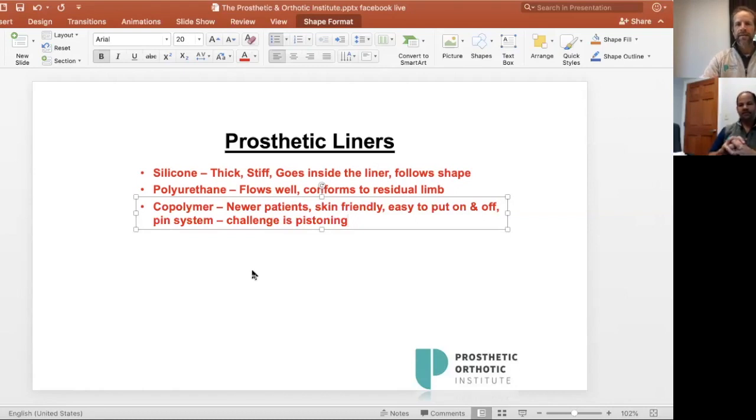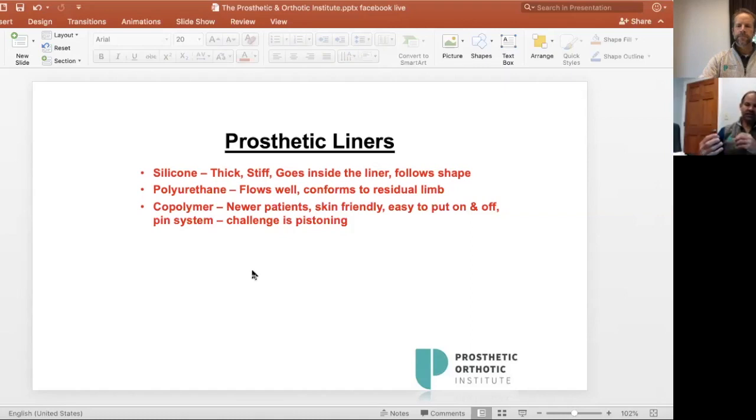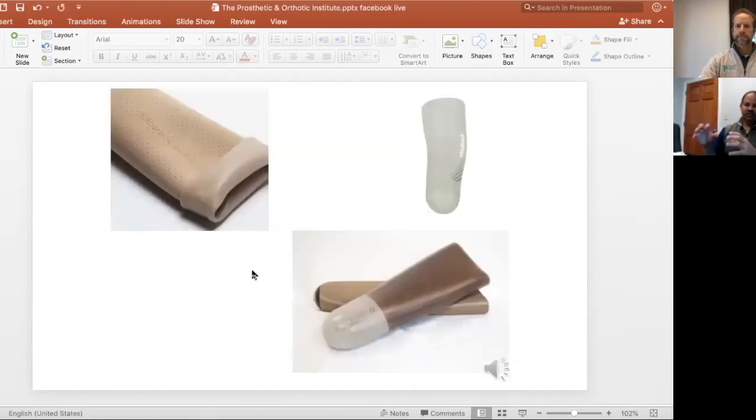So that makes it easier for the patient because it feels like it's more a part of their body. Is that correct? Sometimes I'll have a conversation with our patients, for example, about animals. Cats' whiskers are their proprioceptors, telling them where they are in space. And we as humans take consistent steps throughout the day, right? We know where our feet are going to land. That provides proprioceptive feedback for where we are in space and our environment. The same thing happens with your prosthesis. The more we're able to contact that residual limb and actually attach to that residual limb, the better proprioceptive feedback our patients are going to have with the use of their prosthesis, which means they're more confident during walking and activities outside of the office. Yeah, and that's the ultimate goal. You want it to feel like an extension of their body, like it belongs.